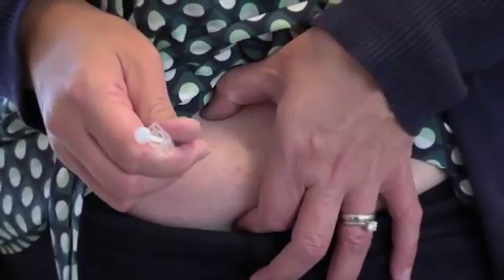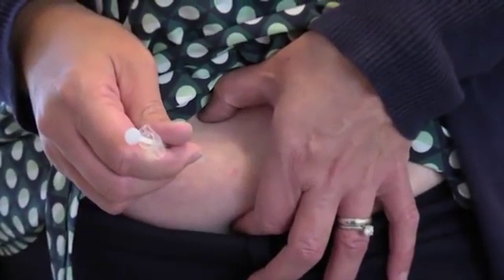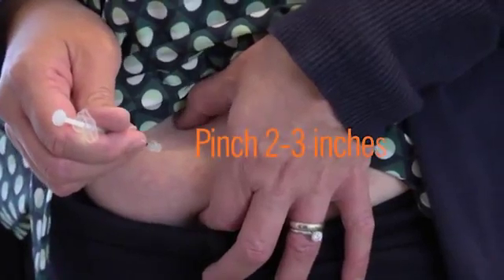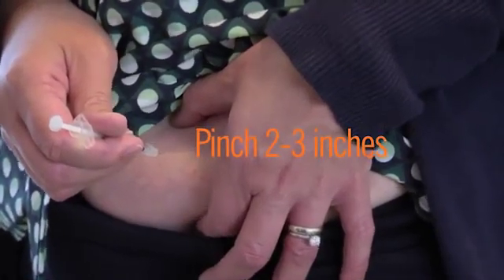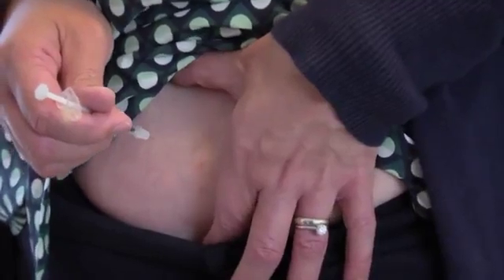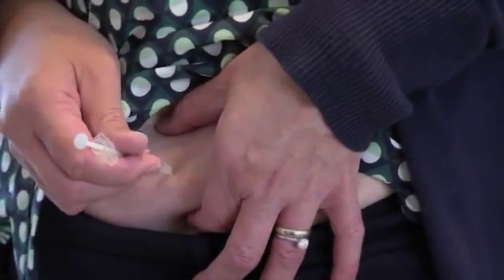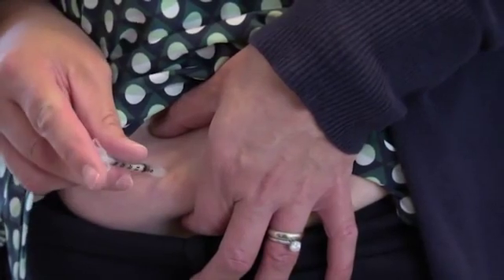Using the hand you write with, hold the syringe like a pen or a pencil, with the needle end down. With your other hand, pinch about 2 to 3 inches on both sides of the clean skin. Insert the needle with a quick motion into the pinched skin at a 90-degree angle. The needle should go all the way into your skin.